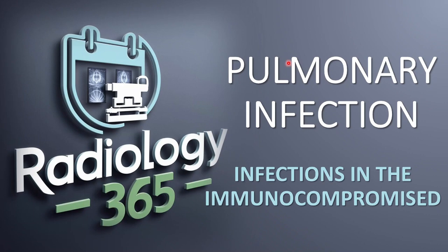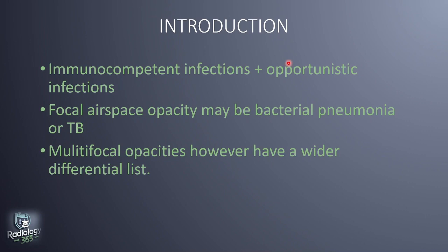Today we're going to be talking about infections in the immunocompromised. Immunosuppressed patients are susceptible to the same organisms that infect immunocompetent patients, but we must be aware of several additional opportunistic organisms that may present in the immunocompromised. An immunocompromised patient with some focal airspace opacity is likely to have some bacterial pneumonia, but TB should also be considered, especially if the CD4 count is low.